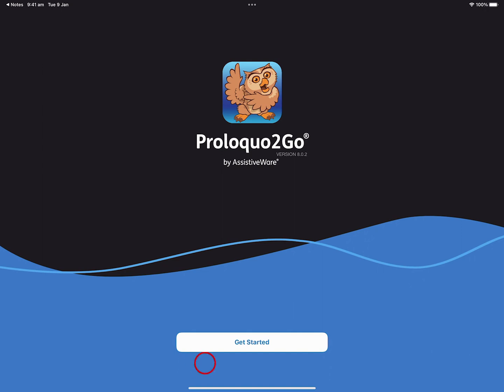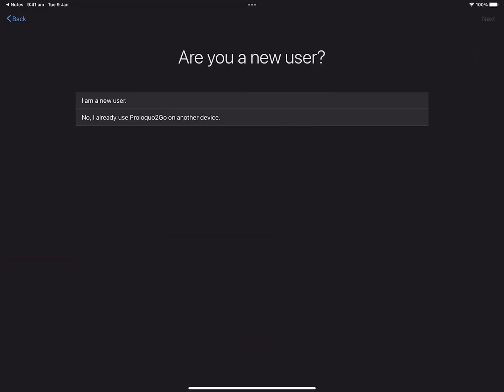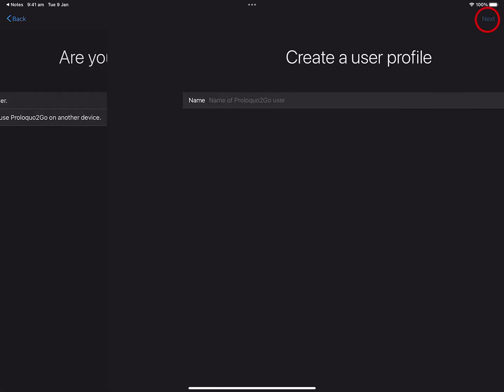From this first screen, tap Get Started. When you start Proloquo2Go for the first time, you have to make a couple of decisions. Let's set up Proloquo2Go as a new user. So I tap 'I'm a new user,' and then tap Next in the top right corner. I'll tap Next through all these steps to create a Proloquo2Go user.